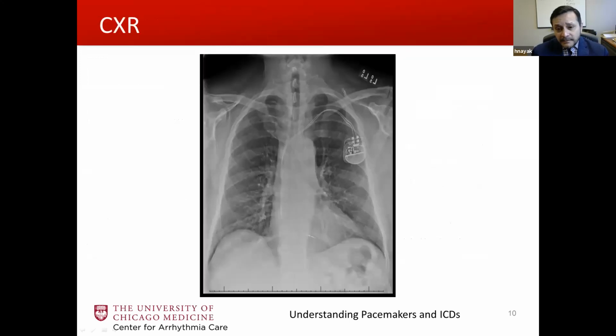So we did an X-ray. Even though X-rays may not always be useful, it's non-invasive and readily available, and you take a good look at his lead. I don't see anything here. You have to take my word for it that we magnified the X-ray and went down his lead. There was no microfracture or obvious break, or macrofracture. But we also wanted to pay attention to the header.